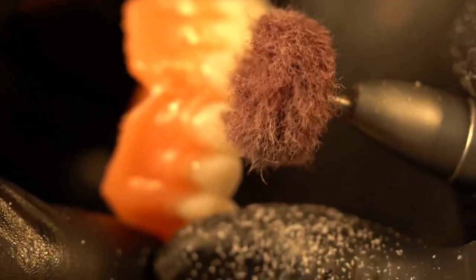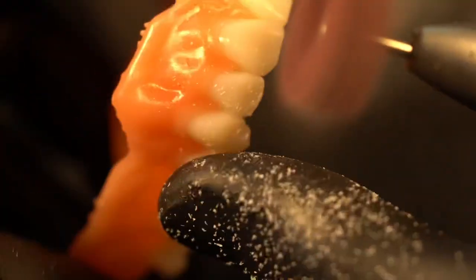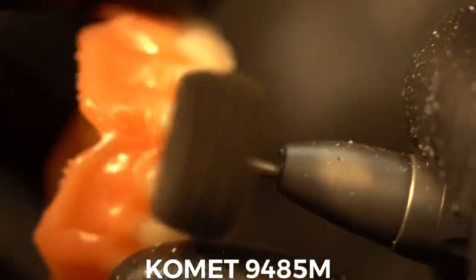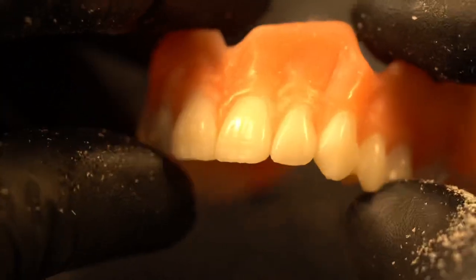Next I switch to a comet flame-shaped diamond, and then one of my favorites is this coarse polishing wheel. It's going to bump off any supports that are remaining that you might have missed with your eye. It's special because it's not going to destroy your anatomy — some coarse polishing wheels will just ruin all your surface texture and anatomy. Then I switch to this medium grit polishing wheel.